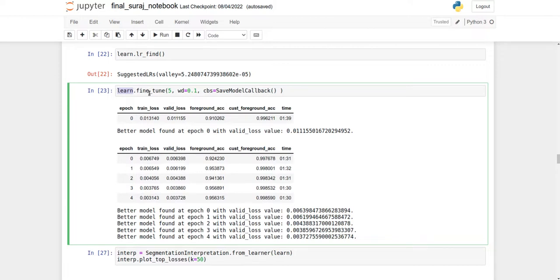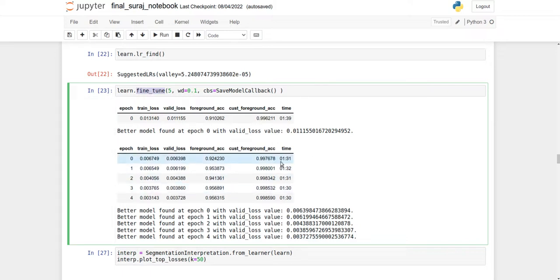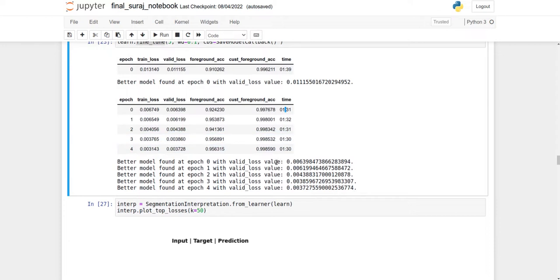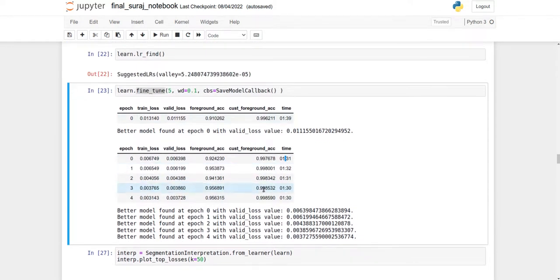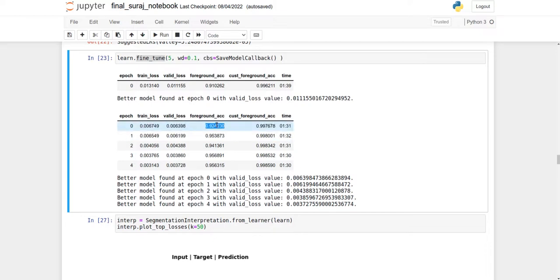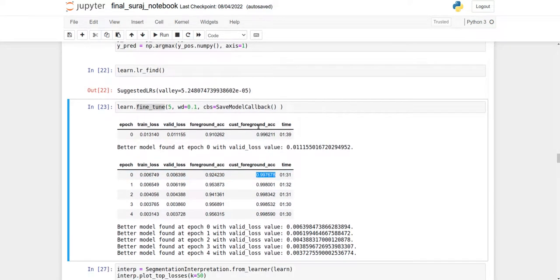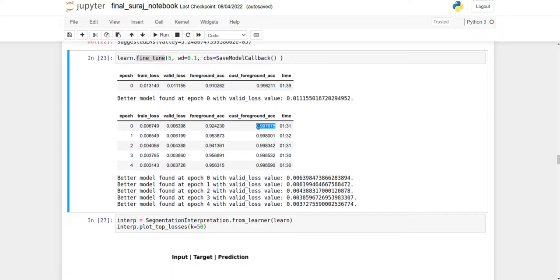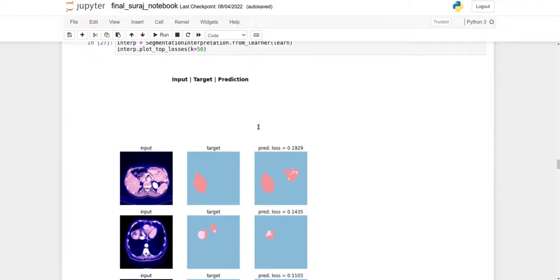Learner.fine_tune tunes the model to your images. For one epoch, it only takes one minute and 31 seconds - a very efficient way to train with large datasets. Pre-trained weights enable quick experimentation. Once you tune the model, you get train loss, validation loss, accuracy, and custom accuracy. As I mentioned, you're doing segmentation and classification: first segment the liver and tumor, with three classes - background, liver, and tumor.